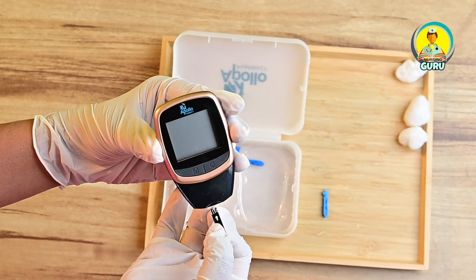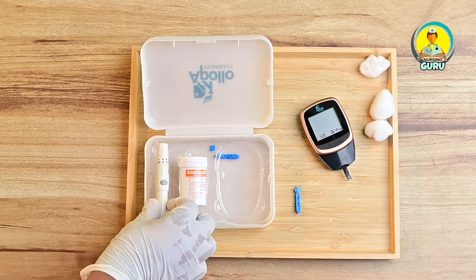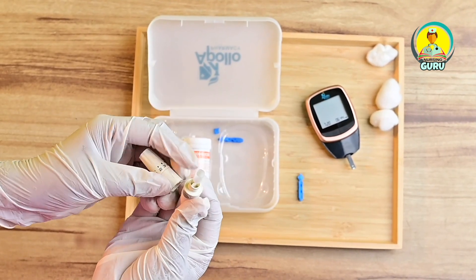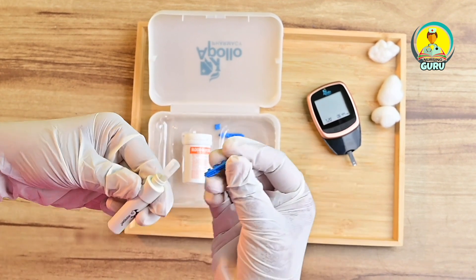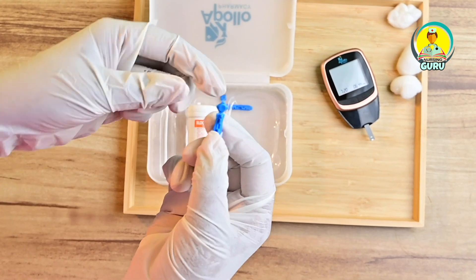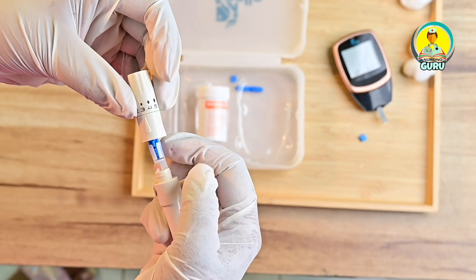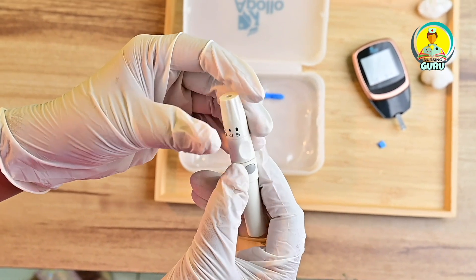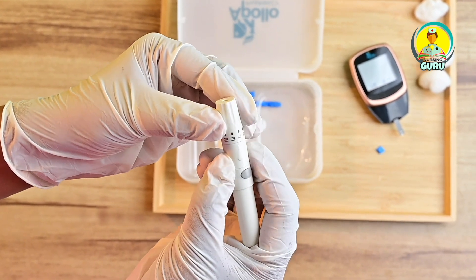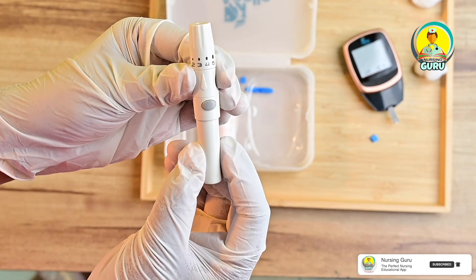Check that the strip code number matches on the monitor. Now take the lancing device and insert the lancet inside it. Twist and remove the cap. Rotate and adjust the device — usually you can use setting 2 or 3. Then pull out the barrel. Now the device is ready.